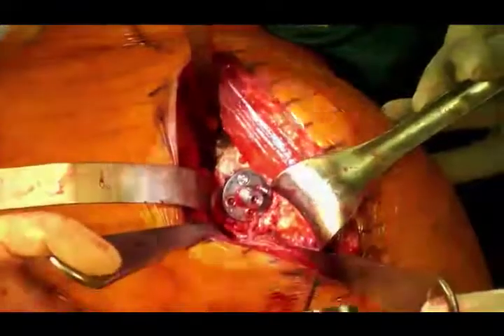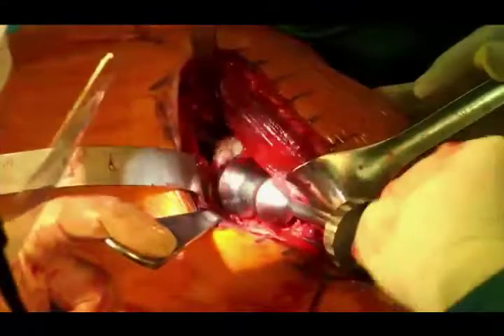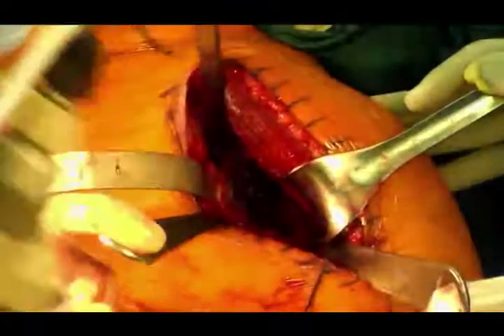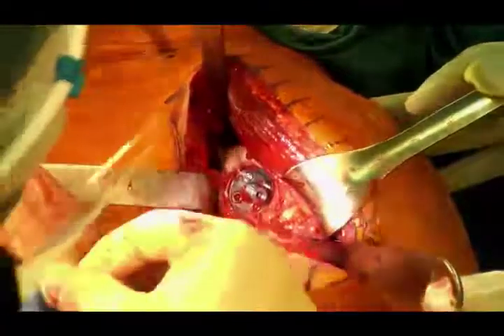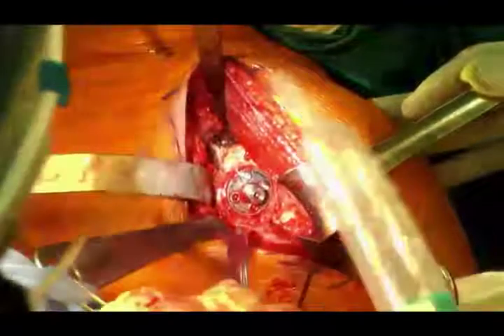Now the glenoid base plate is in. I'm preparing for calcar reaming — essentially planing — to make sure there's no bony overhang that might prevent my Morse taper from engaging on the glenoid base plate. I'll use a burr for this. I've planned it so the bottom of a 36 will sit flush to the bottom of the glenoid. The base plate is 26mm, so the 36 gives me an extra five millimeters of radius.